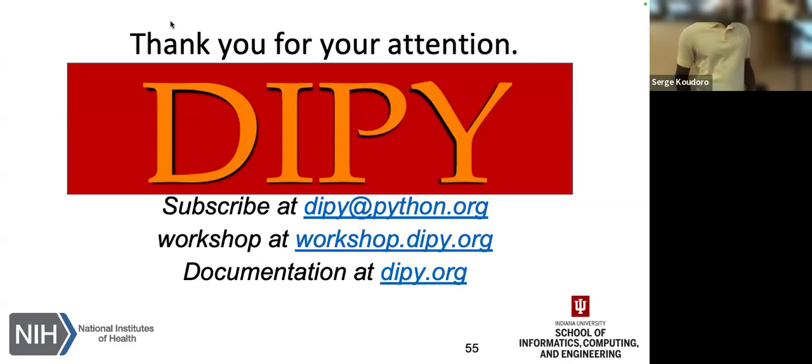Thank you for your talk. It's about how to deal with harmonization when you have a data set that is multi-site, and what are your recommendations for using DiPy to do the data harmonization, if you have different scanner types. This is a complex topic too.